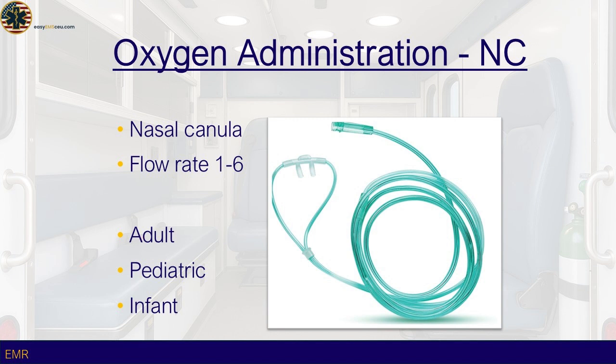Proper placement is also crucial. Prongs should face downward into the nostrils to ensure efficient oxygen delivery. While nasal cannulas are a simple device, their correct application and monitoring are vital in ensuring patients receive adequate oxygenation while avoiding potential complications in the field.